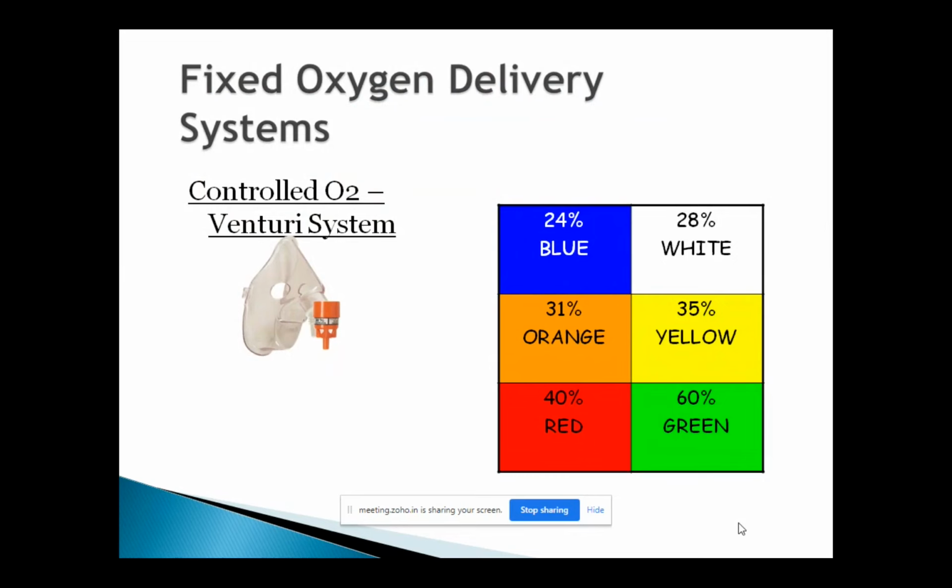Then you may say, how can I give 24%? How do I know how many liters of oxygen I have to set to give the 24%? It's very simple. You don't have to worry about it. You look at the valve. It is very clearly printed on the side of the body of the valve: for 24% oxygen, you need to set 2 liters. The manufacturer's instruction is very clearly on the valve. For example, if you take the white valve, it will say that to give 28% oxygen to a patient, you need to set the flow meter to 4 liters.